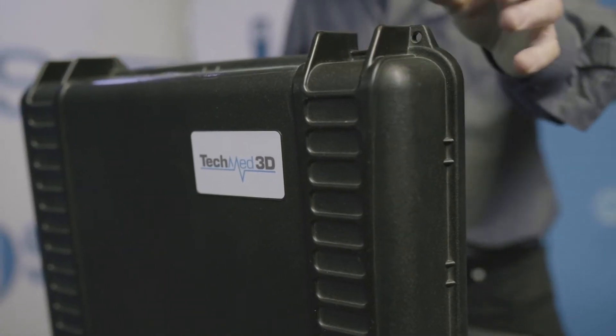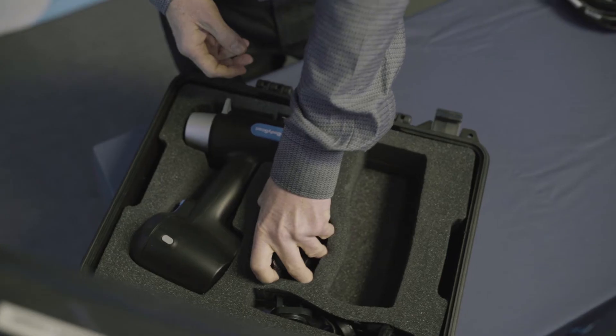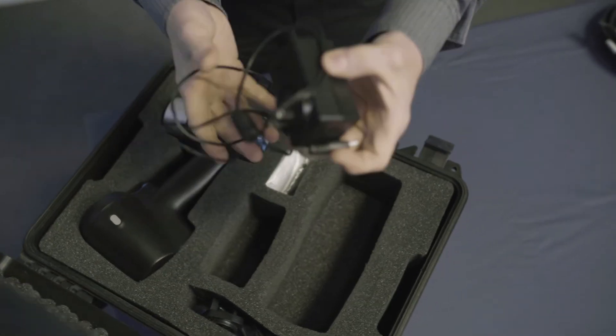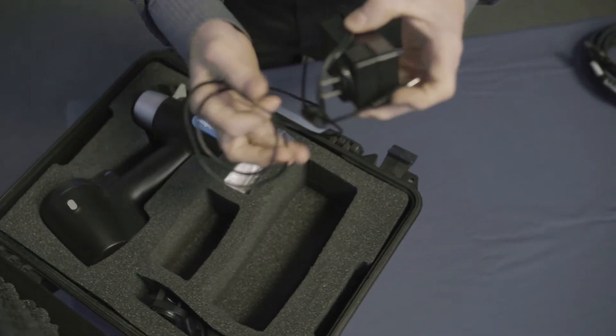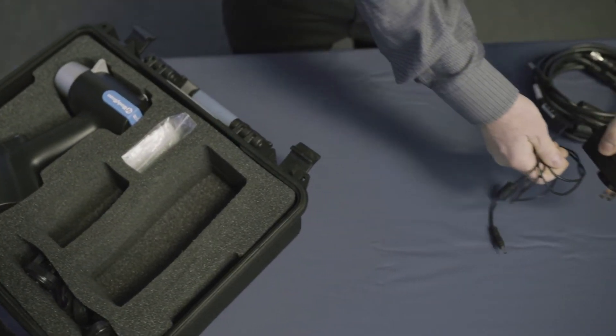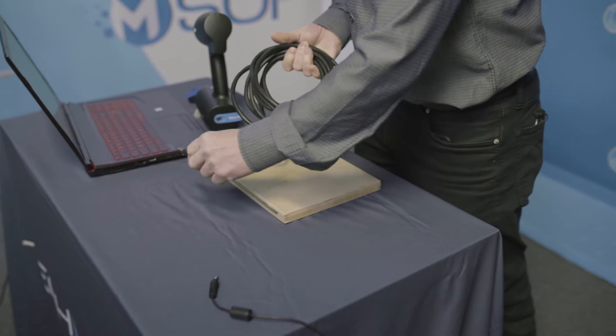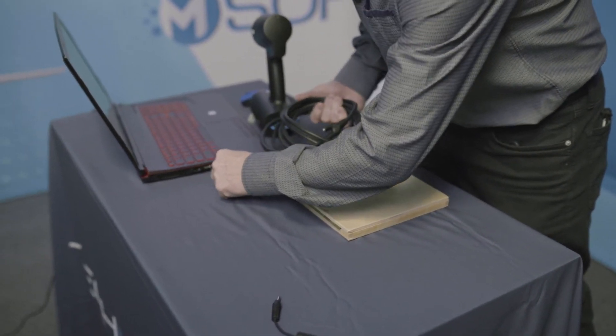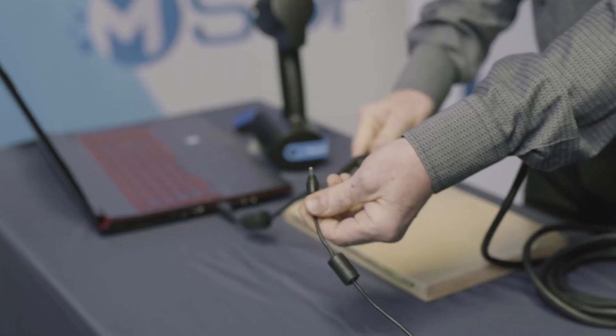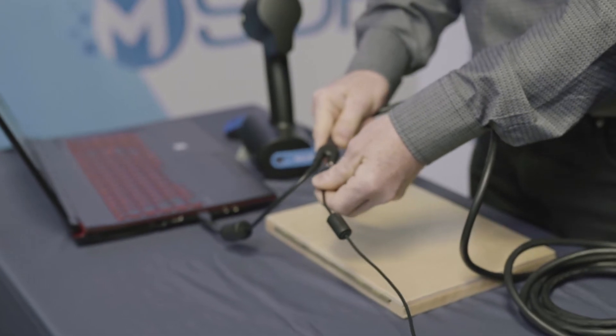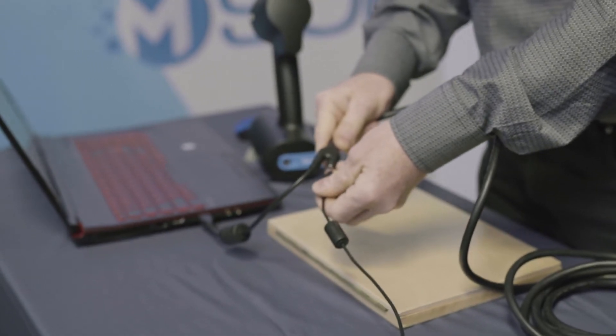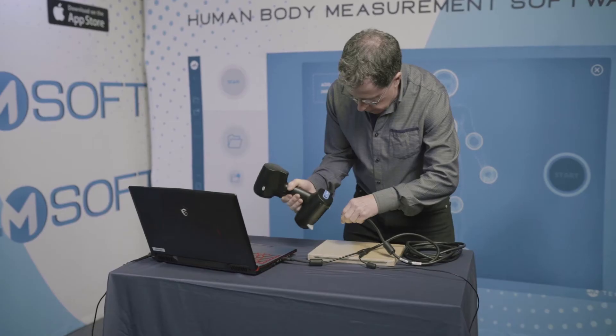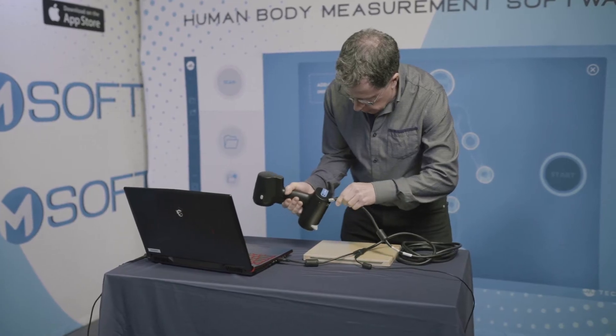Start with plugging your scanner in the proper sequence. First, plug the power supply into the outlet. Second, connect the USB cable into the USB port of your computer. Third, connect the power supply to the Y-shaped adapter. Finally, plug in the body scan.